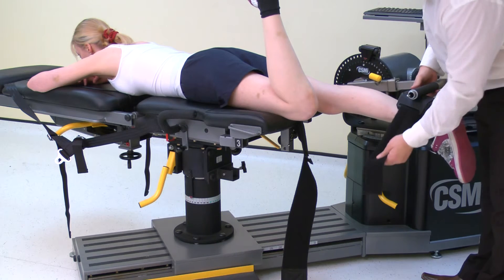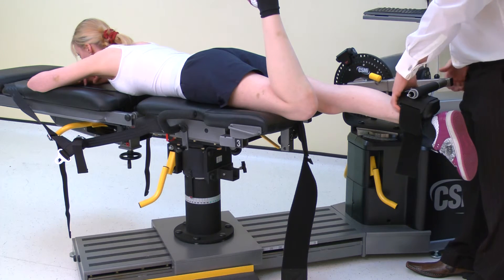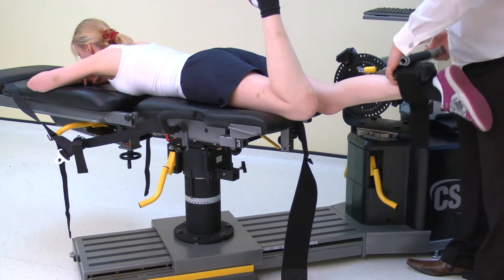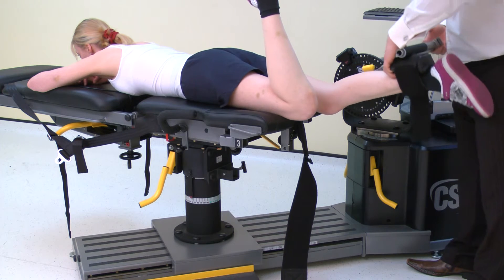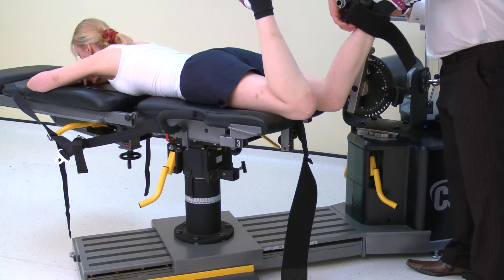To check the axis of rotation and the position of the pads, hold the calf pad next to the shin, then extend and flex the knee manually. If the pad rubs up and down the shin, the axis of rotation is wrong. Release the calf pad and reset the axis of rotation.